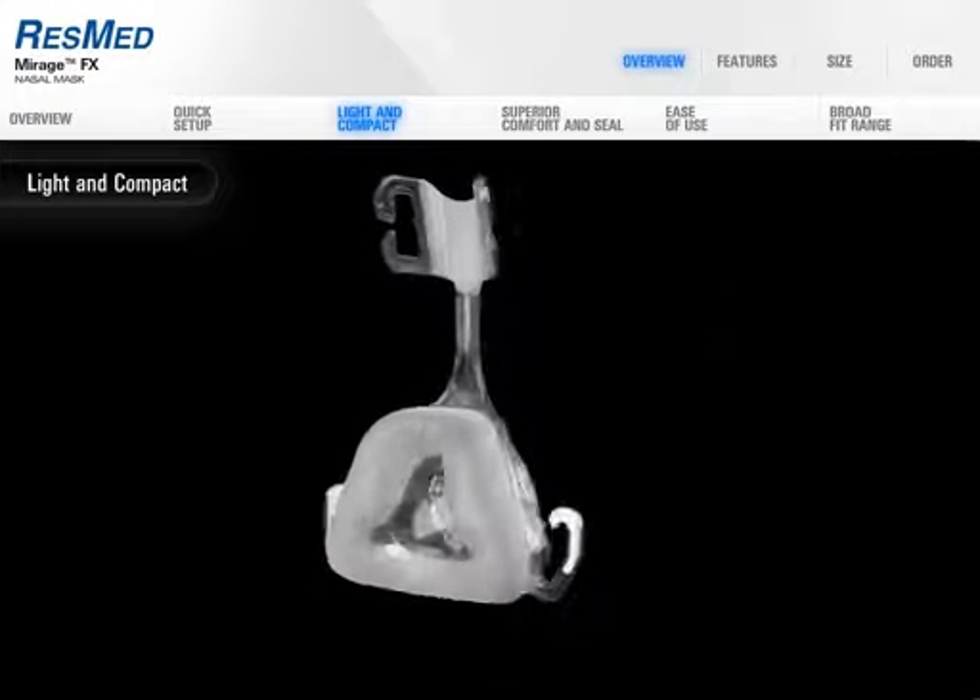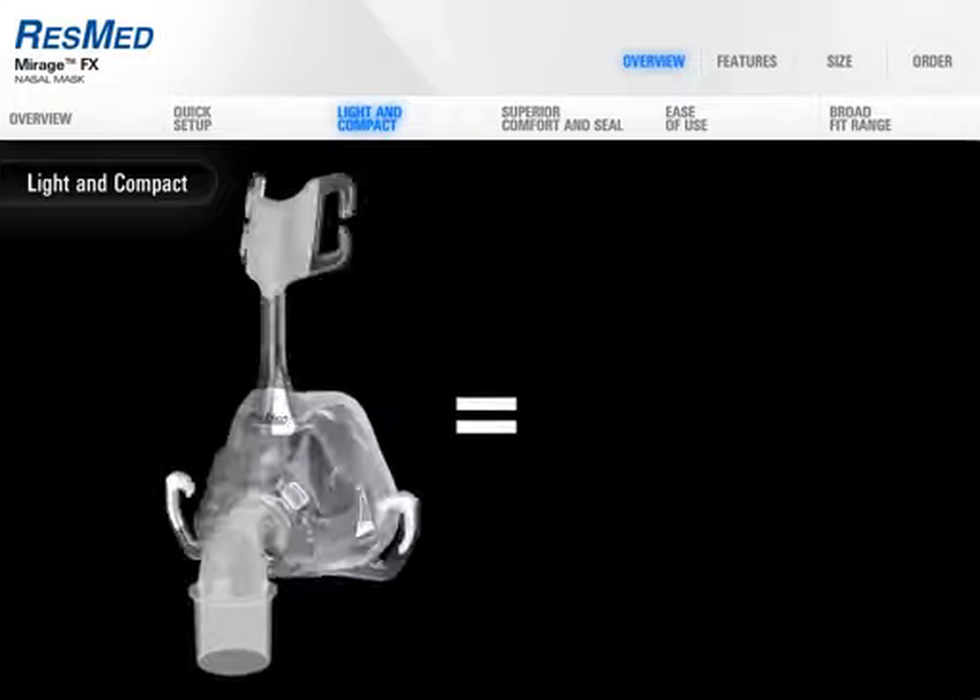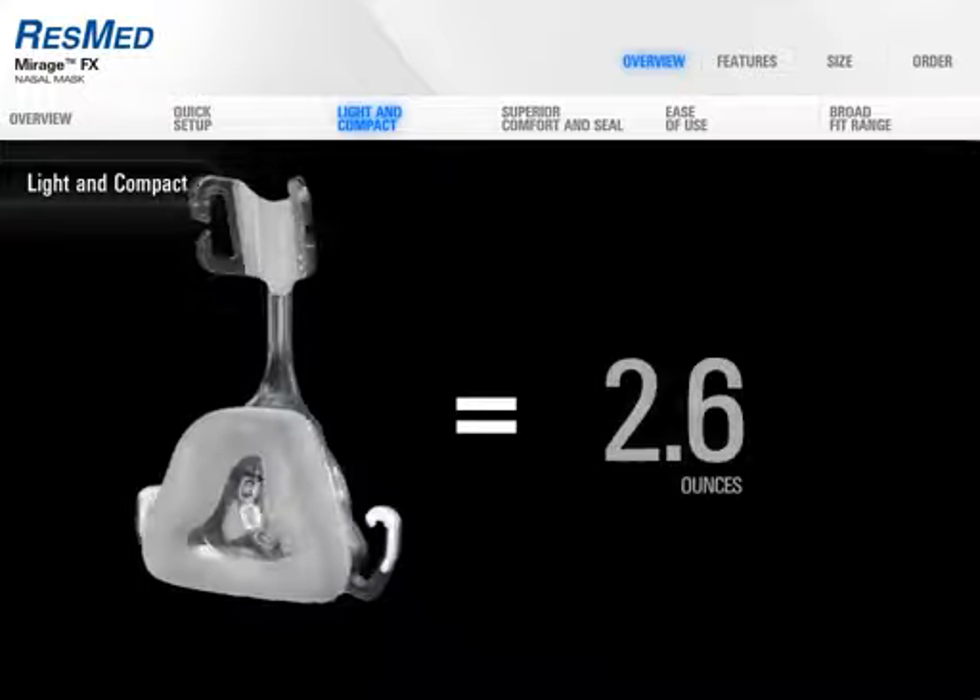Mirage FX uses next generation materials, weighing in at an incredibly light 2.6 ounces.